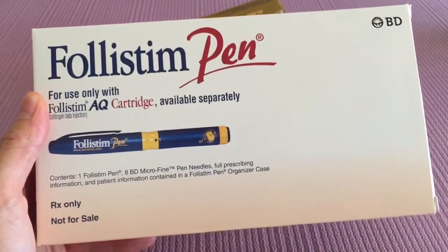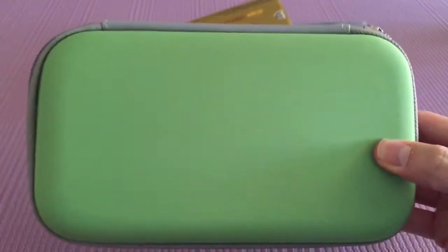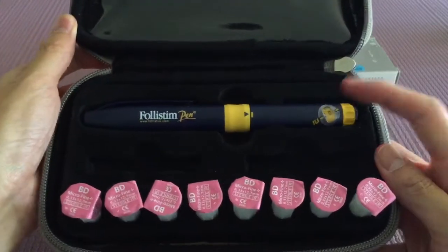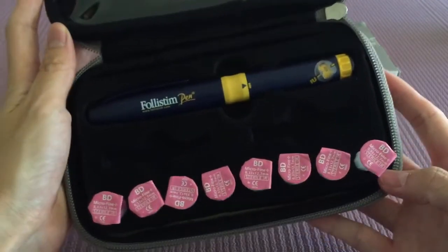Hi everyone. This is the Felistin pen, and you're going to be using this to administer the Felistin. Let's open it up — inside there's a little kit. You have your Felistin pen and these little needle tips that are going to go on the end of the pen, and I'll show you how to do that in a second.